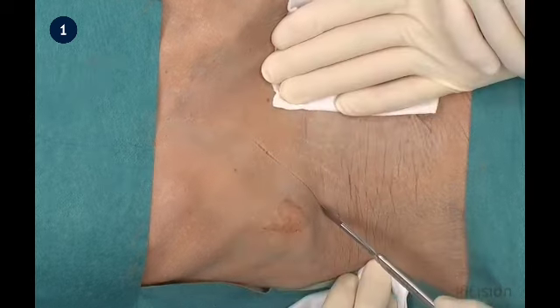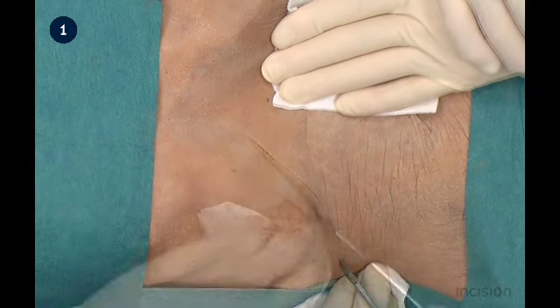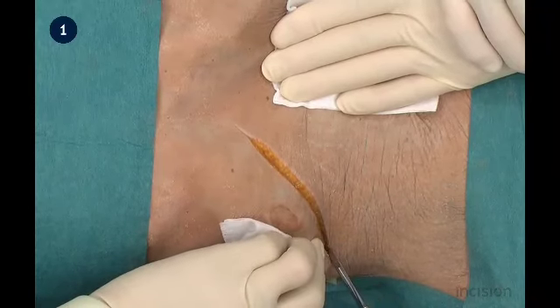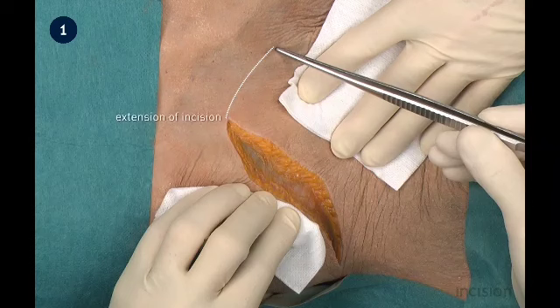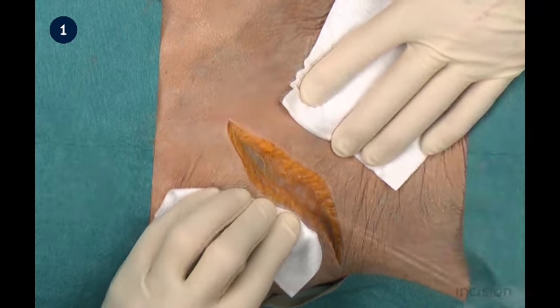The skin is incised over the previous marking, and the subcutaneous tissue is also incised. Take note that in case the incision needs to be extended, this may be done across the midline, as is now pointed out. It may even be continued in the same manner on the other side of the midline, as a chevron incision. For a more detailed elaboration of this, refer to the course Abdominal Wall Incision, Chevron.